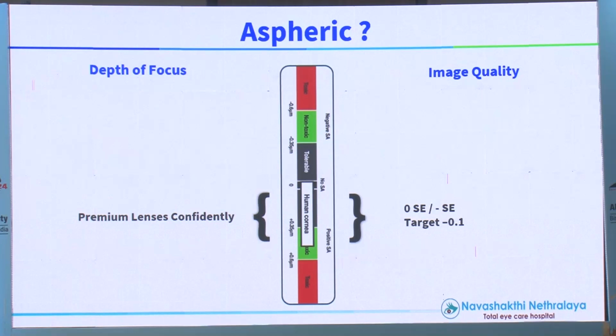By chance, if the patient is not affordable and wants to go with a monofocal IOL or an advanced monofocal IOL, I'll take a little bit of time. There are some speakers not there, so I can afford to. What should the target be? The target finally should be 0.25 to 0.3. So our patient has 0.52. When you put in 0.17, there's a lens available with that also.